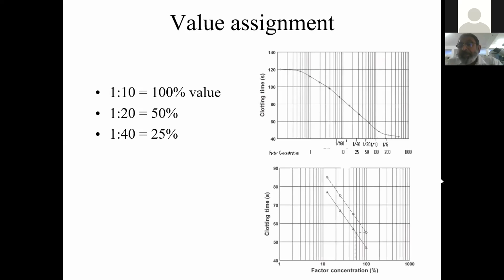If it's very far away, then there's a problem with that dilution. So all the dilutions, which basically reflect the concentration, because as you dilute the plasma, you get different concentrations of factor VIII. And when they are assayed, they should be connected by a straight line. So that is rule number 1.